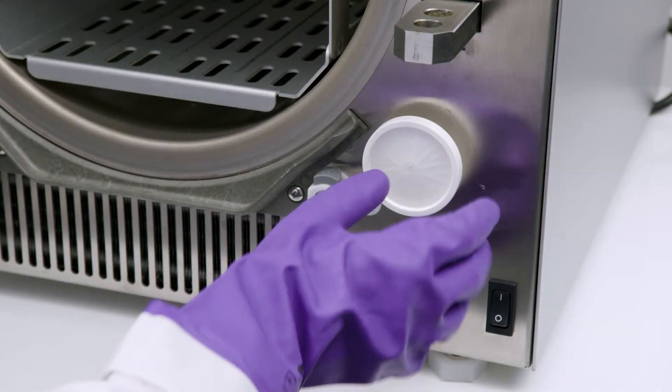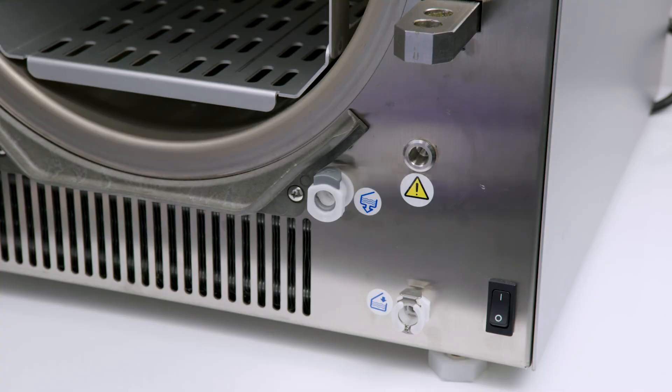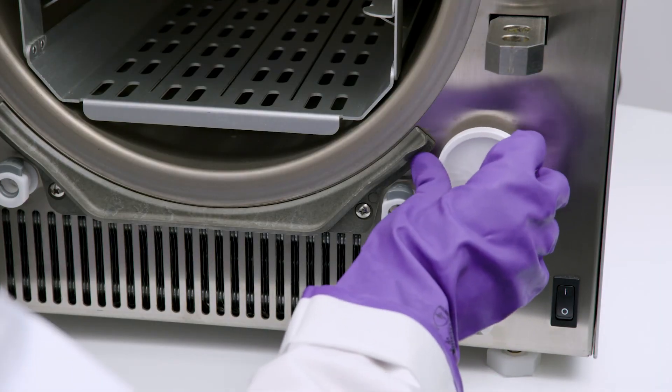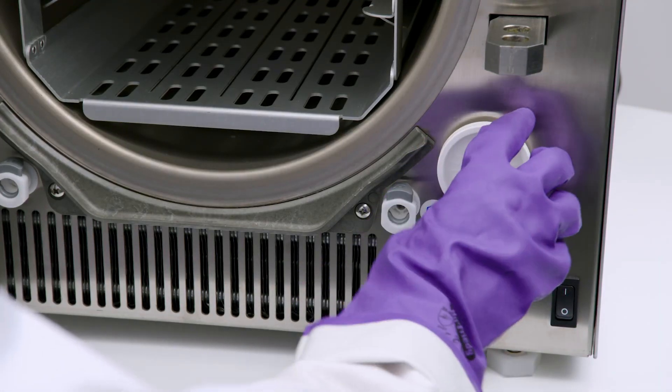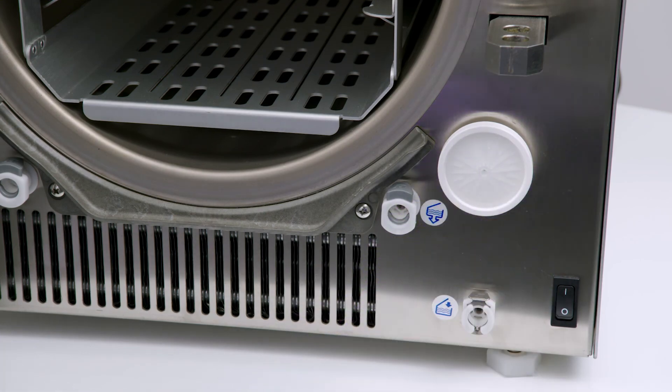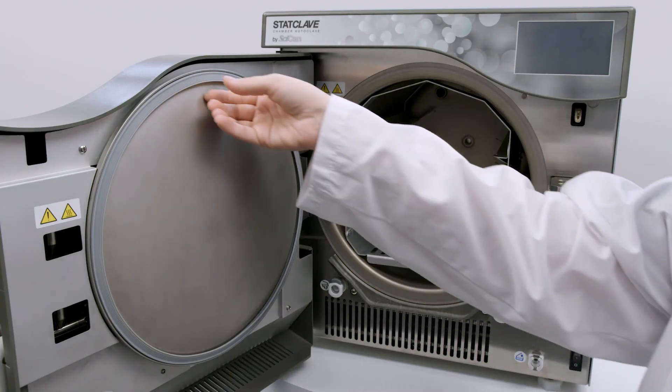Every six months or after 500 cycles, you should perform all the cleaning tasks listed in the monthly schedule. Also replace the bacteriological air filter and replace the door seal.